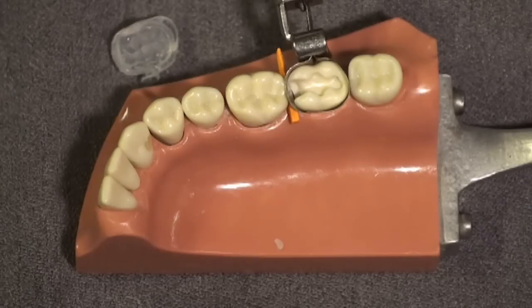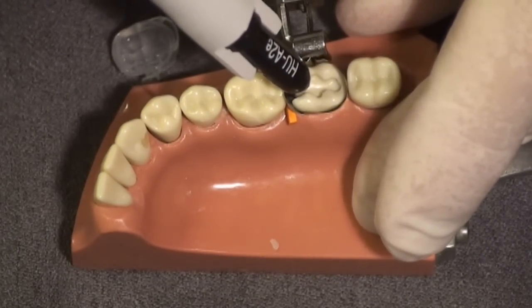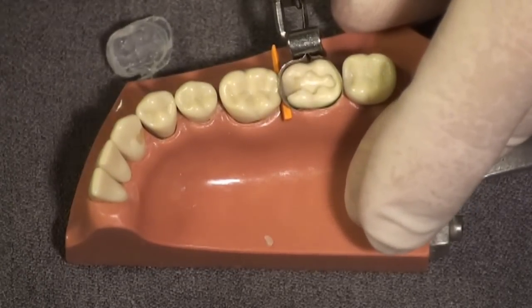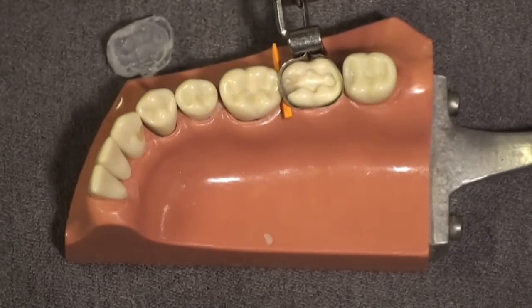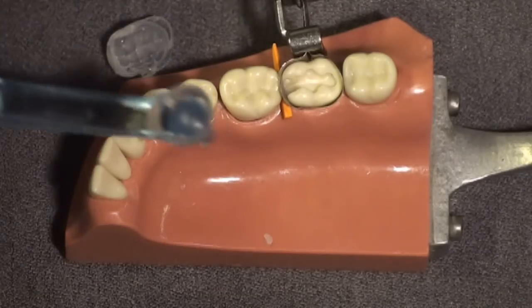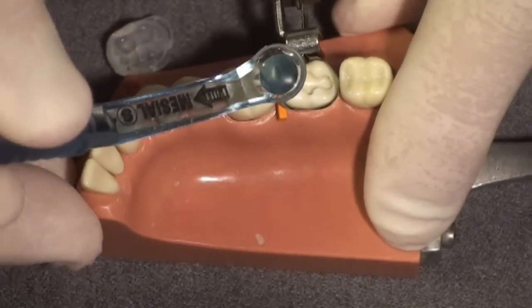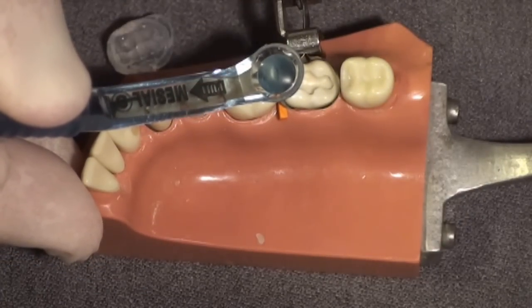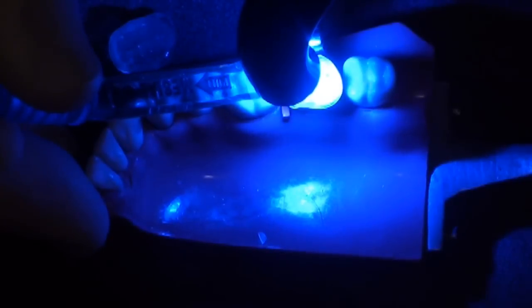When placing a class 2 light cured composite I use two increments. The first increment is used to get the contact — I place a small amount of composite into the proximal box, condense it well to ensure no voids, then take an instrument called the Contact Pro, which has a mesial and distal end. I place this into the proximal box and pull, then take the flat end of the light curing bundle and cure through the instrument, curing in a bridge of composite up the side of the matrix band, holding it in place into contact.